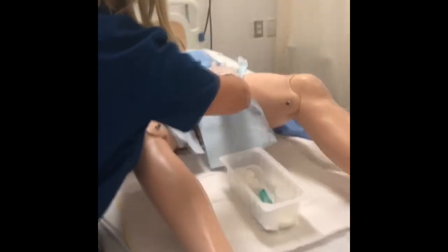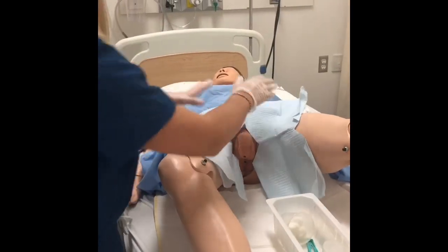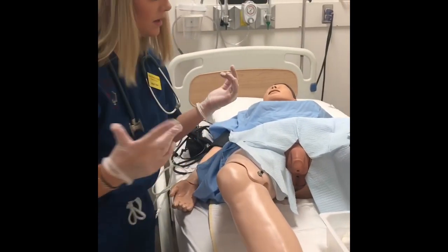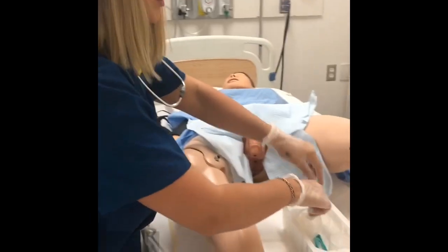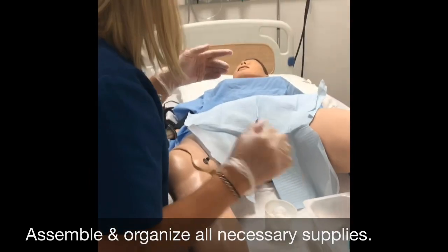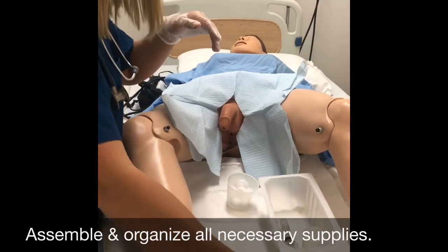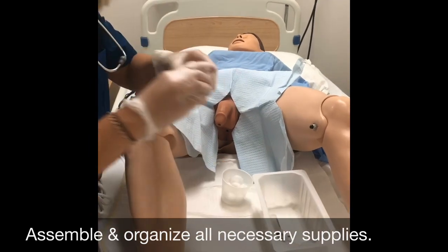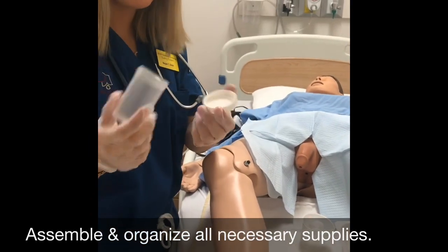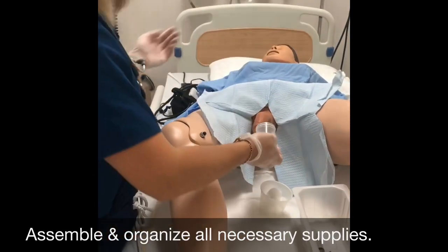So I'm going to place the fenestrated drape over the patient's abdominal area, only exposing the penis area. After that, I'm just going to prepare my sterile field. So I'm going to get my cotton balls ready, tweezers. I have this pee cup, I'm going to have it open in case I need a pee sample from the patient.